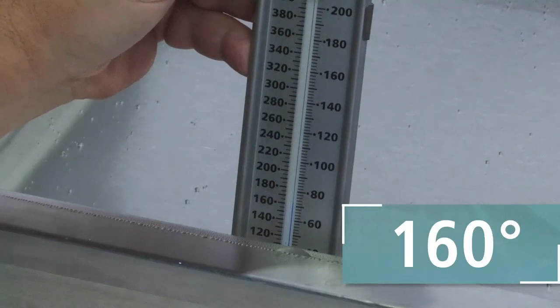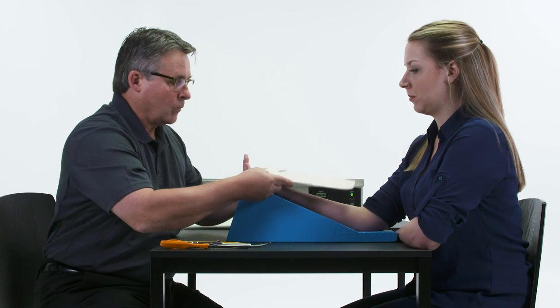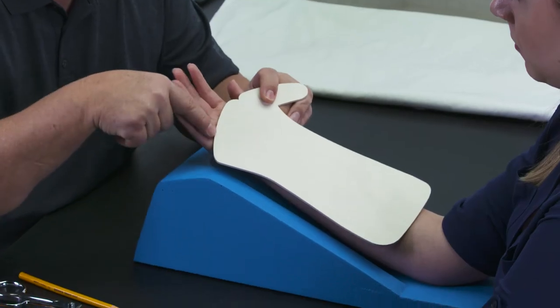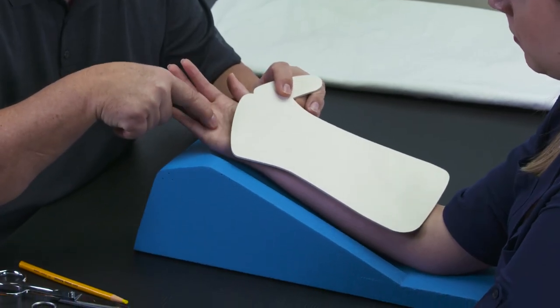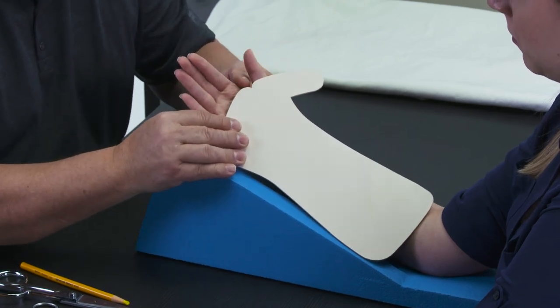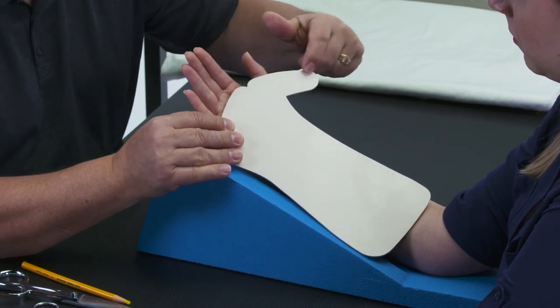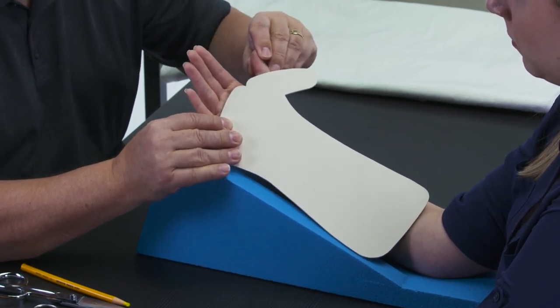Turn on the splint pan and heat to 160 degrees. Place the pre-cut on the patient's arm, ensuring that the splint is the proper size, long enough to reach the distal border at the palmar crease, the notch at the thumb web space, and the IP joint border. This is the position that the heated splint will be placed in prior to forming.